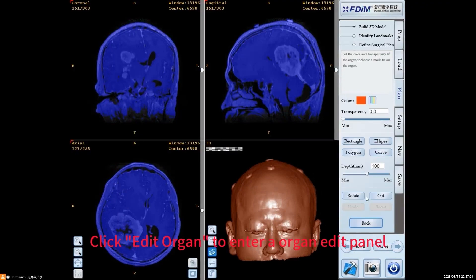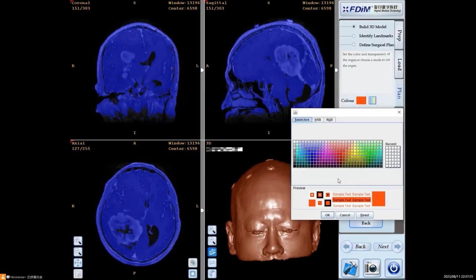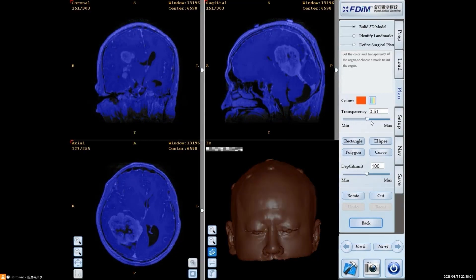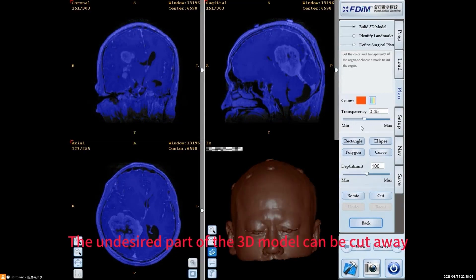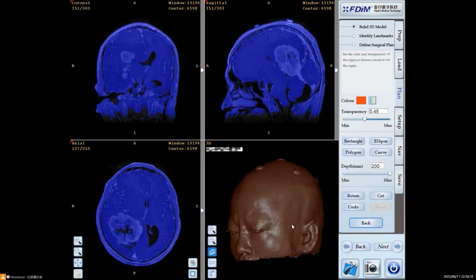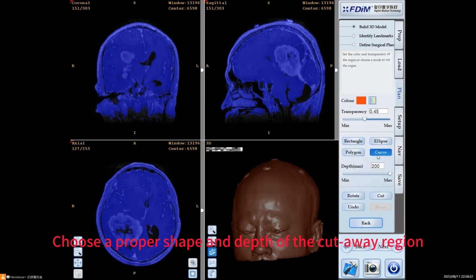Click Edit Organ to enter the Organ Edit panel. Change the color and change the transparency. The undesired part of the 3D model can be cut away. Choose the proper shape and depth of the cutaway region.